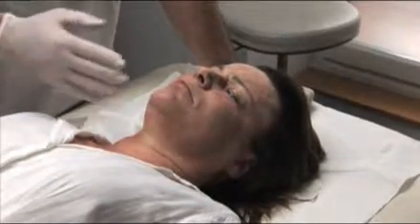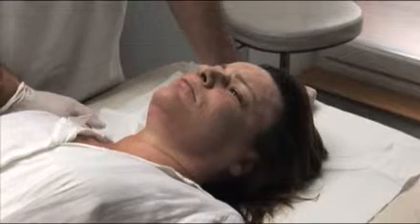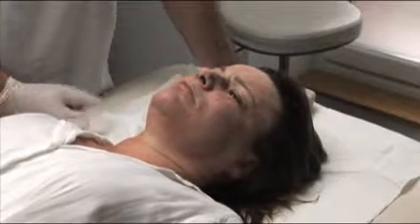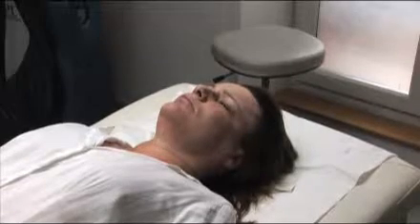On the submaxillary area, we applied a progressively increasing intensity with fewer passages than on the rest of the face. And apart from the upper eyelids that were voluntarily left, the whole face was treated. We induced a superficial epidermolysis of the face. It will take 4 to 5 days to heal.